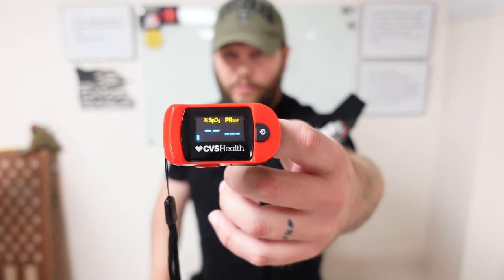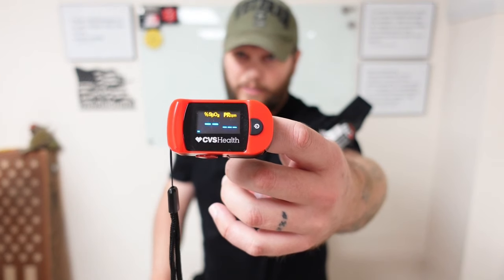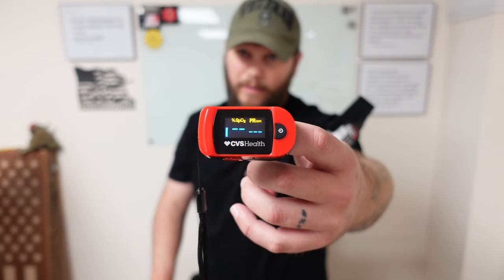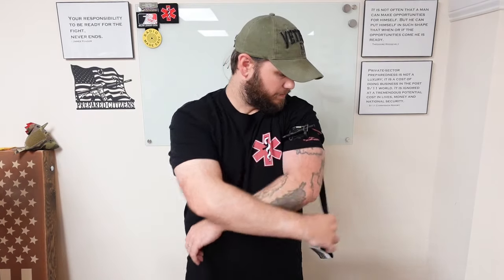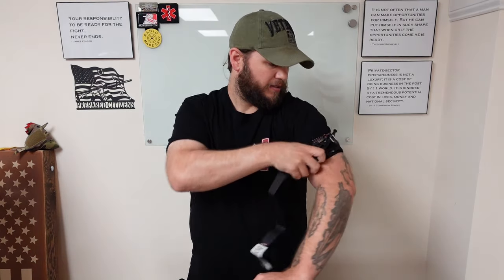Let's see if we're going to get anything — it doesn't look like we're going to get anything. Yeah, nothing — I think we're good, guys. Training is done with this tourniquet. I'm going to remove this baby. Worked really good. It works.